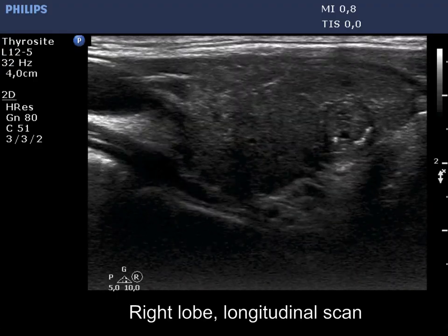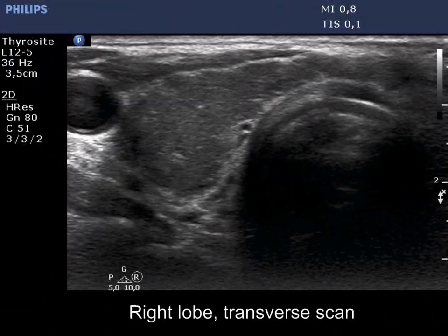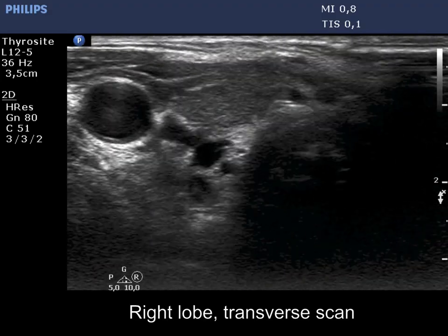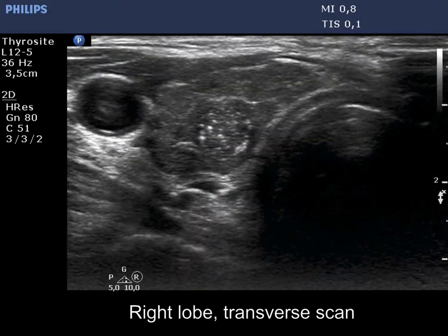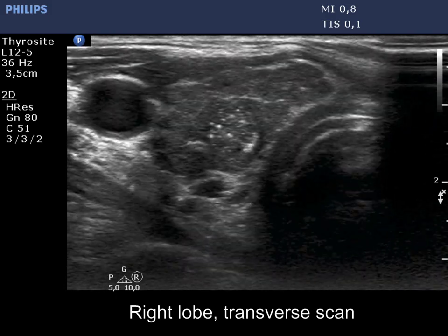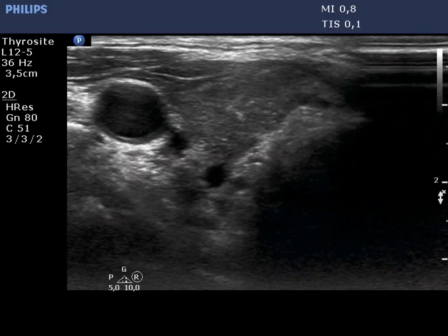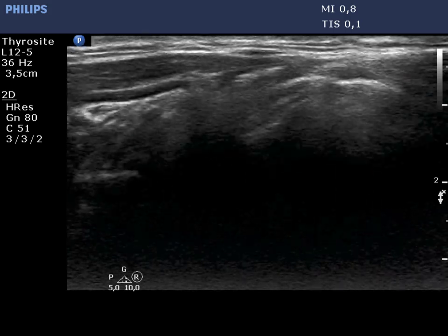Now the enlarged view is demonstrated. Let's see the shape of the nodule. The width is lower than the depth, so the nodule presents a taller-than-wide shape.